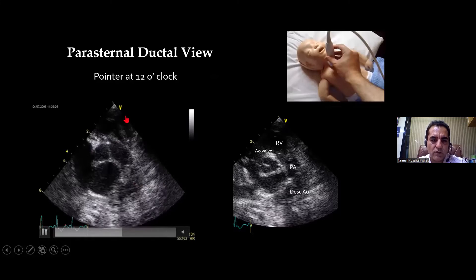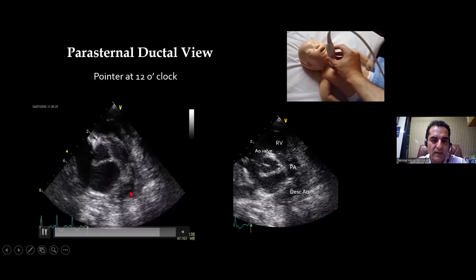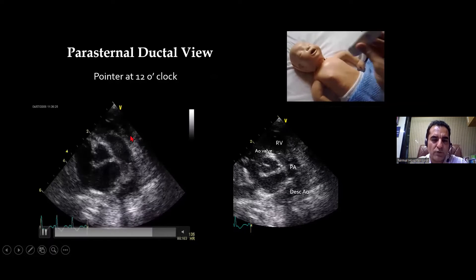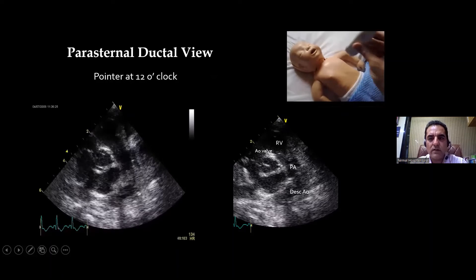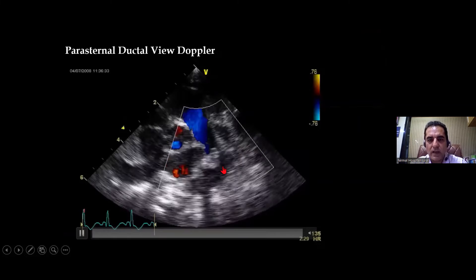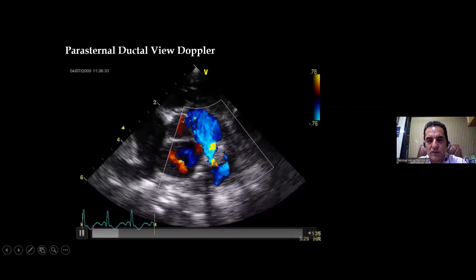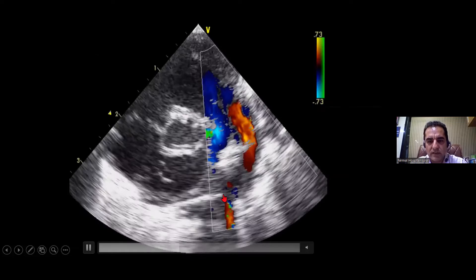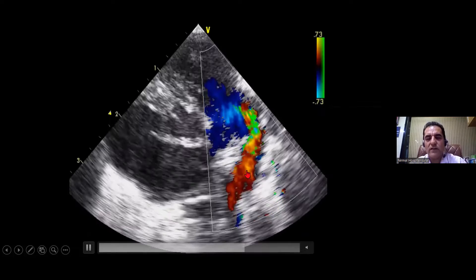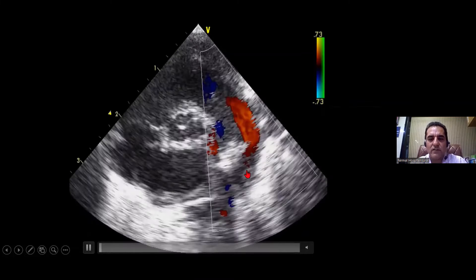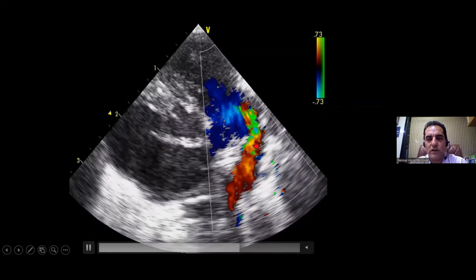With color Doppler, blood flowing away from the probe appears blue. If a PDA is present and blood flows from the aorta to the pulmonary artery — that is, left to right — it flows toward the probe and appears red. In this example without a PDA, there is no connection. In the next example, a clear red jet from the descending aorta moves toward the pulmonary artery, confirming a PDA with purely left-to-right flow.